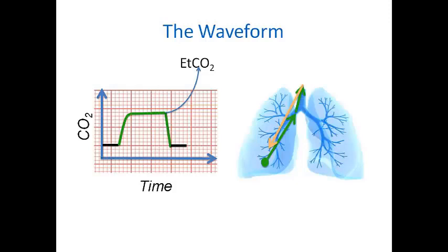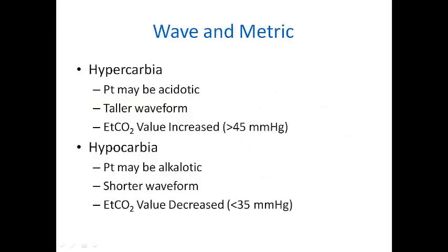As we move closer to baseline, the patient has now drawn air and gases back into their lungs and taken the measurement gas away from our measuring device and into the lungs as they oxygenate. Putting these things together, we can look at the ranges outside of our normal values. Hypercarbia and hypocarbia are related to larger and smaller values of CO2 than our normal range.